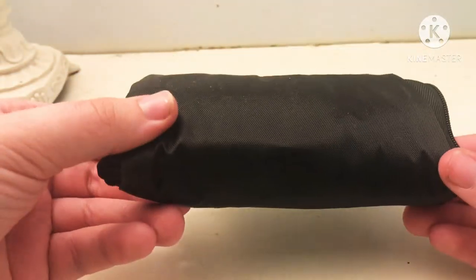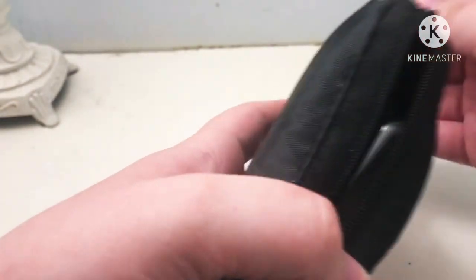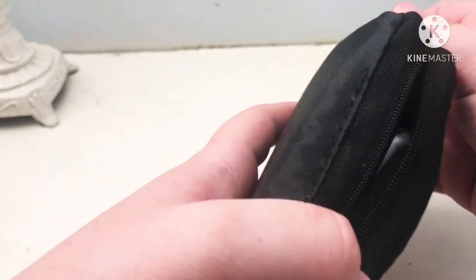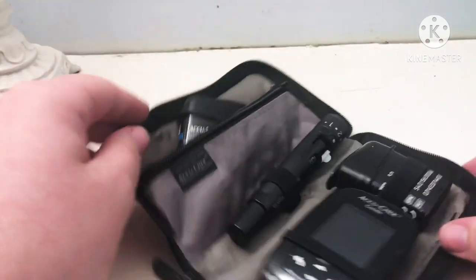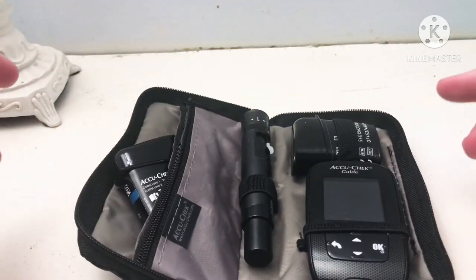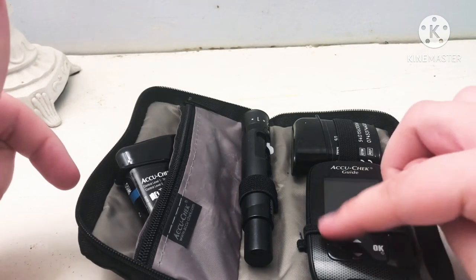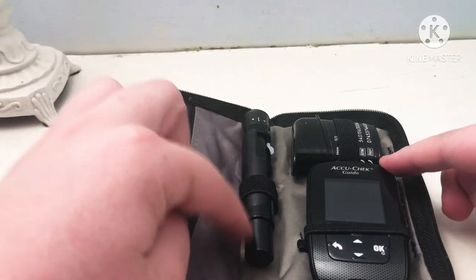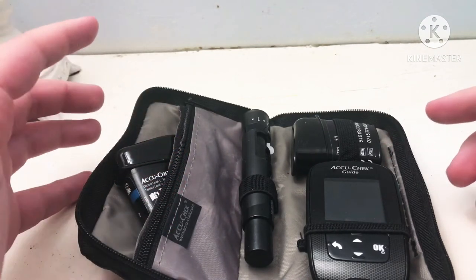So putting the box aside, this is what you get — a cute little case. Mine is fuller because I have test strips and extras added in. When you get the AccuCheck, you only get the device, the lancing device, and one lancet.